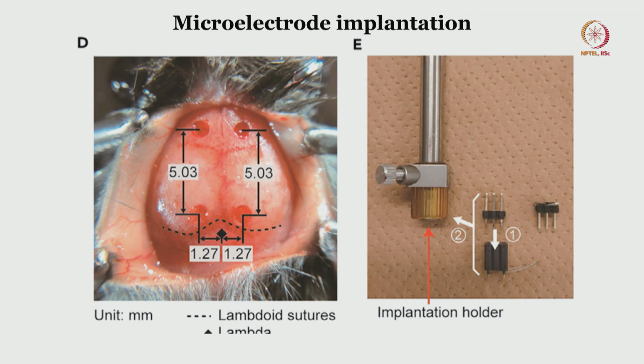That is the importance of mastering the basic general neurosurgical steps, and that is the whole point of having this session in the first place. If one masters these, then you can do any number of various experimental methodologies on the same models.